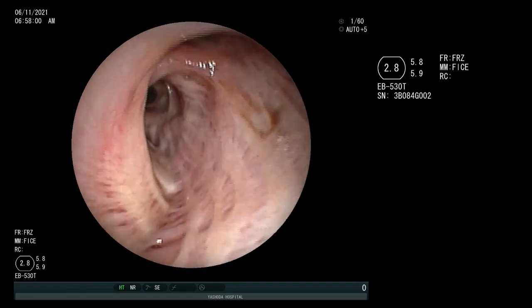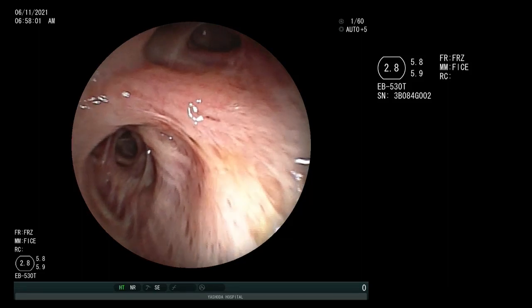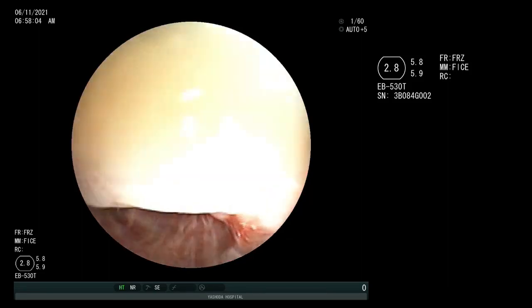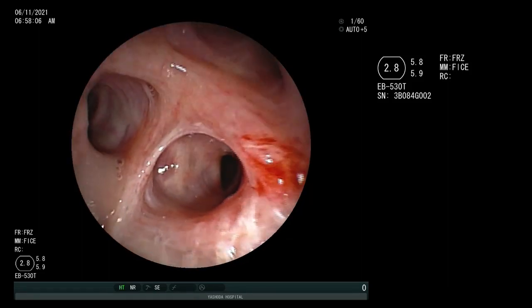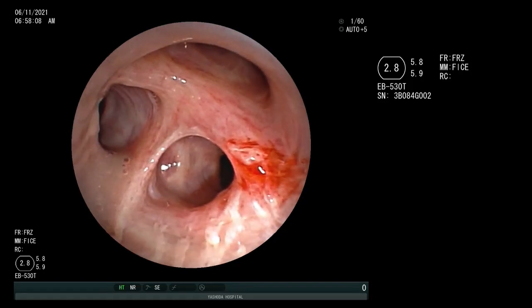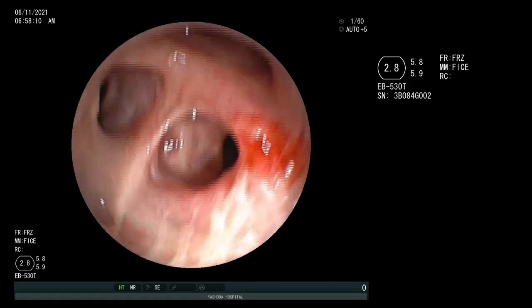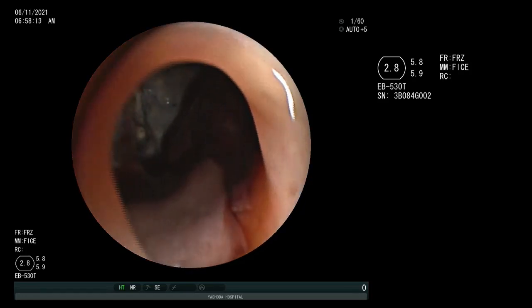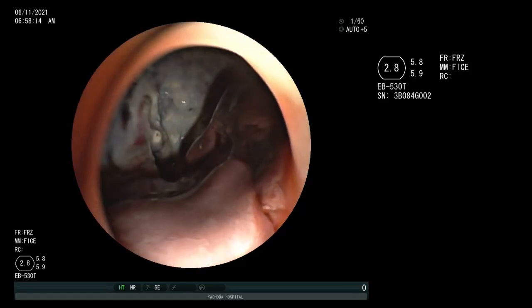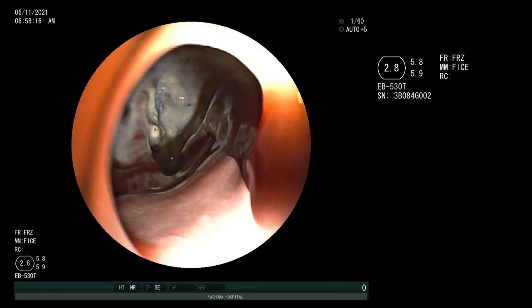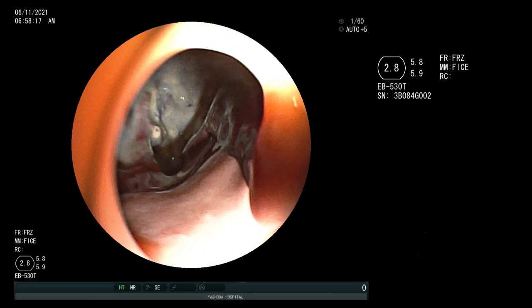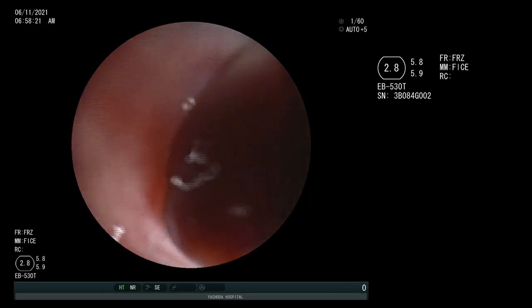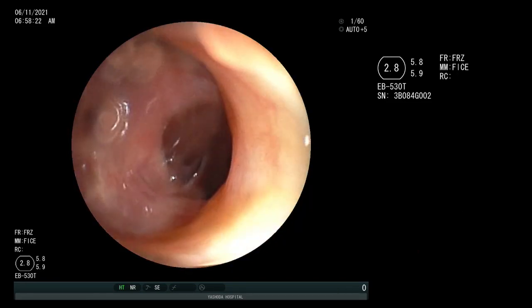This elderly man was diagnosed to have reactivated pulmonary tuberculosis with hemoptysis. CT scan shows a large cavity and destroyed lung parenchyma of the right upper lobe. A flexible bronchoscopic examination with Fujifilm EB-530 bronchoscope shows the RB2B segment opening directly into the cavity of the right upper lobe.